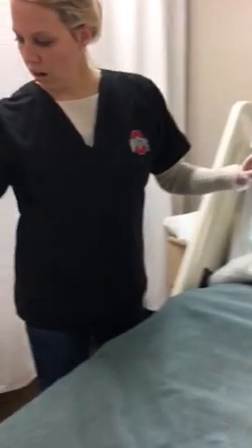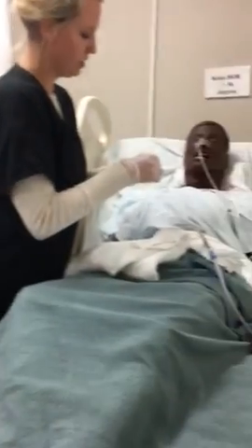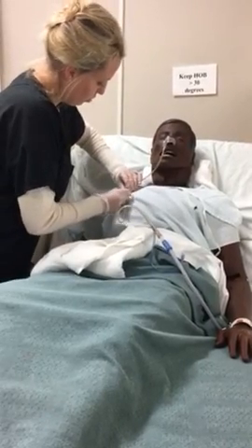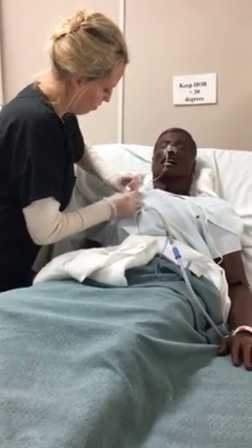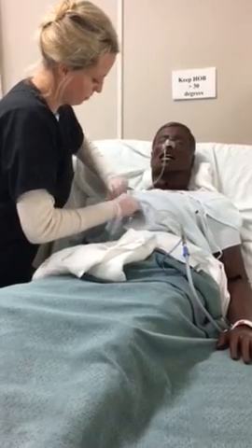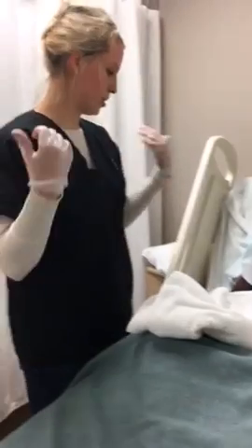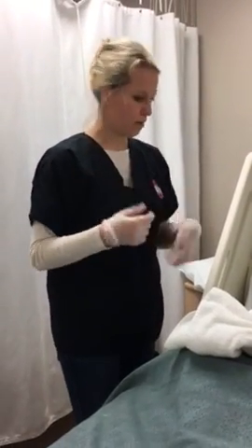And have you ever been diagnosed with esophageal issues? No? Okay. And then I'll grab a safety pin and secure the tubing to the patient's clothing, just so it doesn't get pulled out. Well, just in case, let me take a quick peek and inspect your nostrils and your oral cavity. And then I'm just going to clean up, take my gloves off, perform hand hygiene.